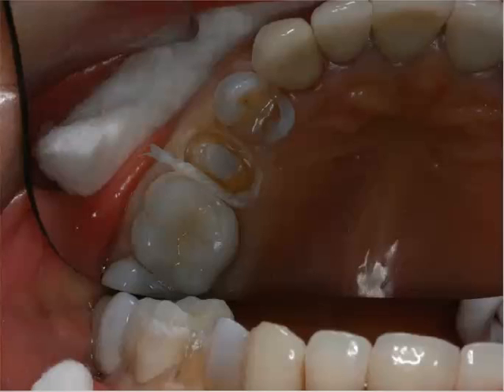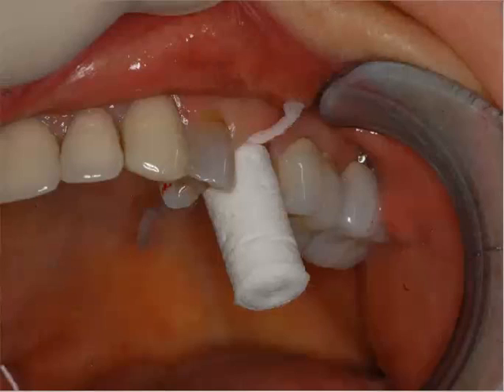So the first thing we can do, we've already done our preparation. I'm not going through all that. We have our rounded shoulder preparation. All our internal line angles are round, no sharp internal line angles. We have a smooth axial surface, so we're ready to take the impression. In this case, we had minimal or no bleeding. We're able to take the #2 cord, which has been soaked in the Hemident, and place it in the sulcus for 2 minutes.